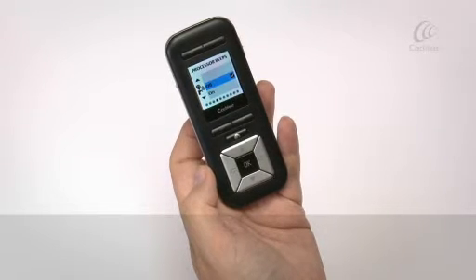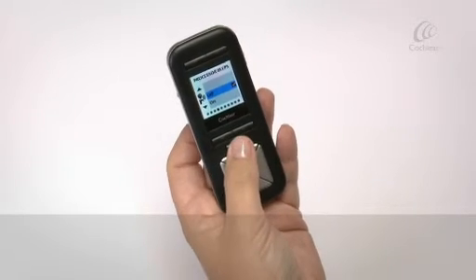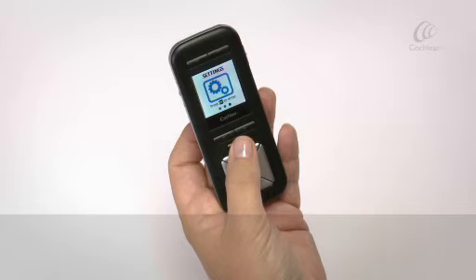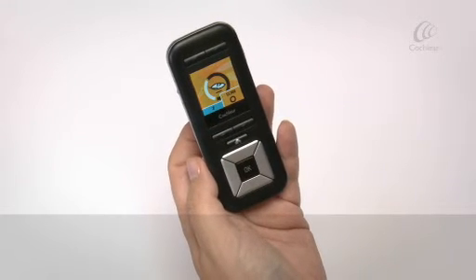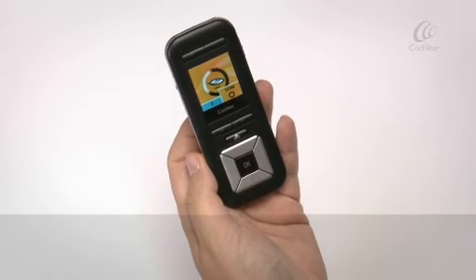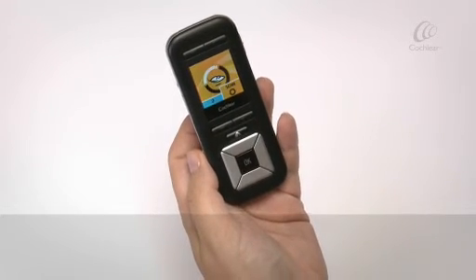You can turn on or turn off various indicator lights on your processor. These are detailed in the user guide.